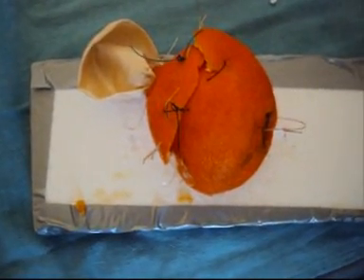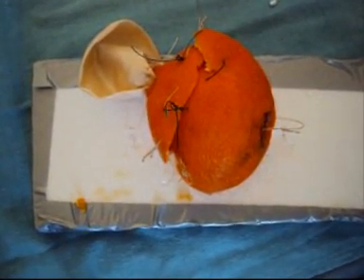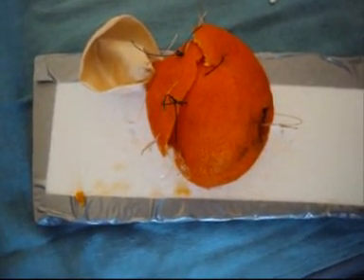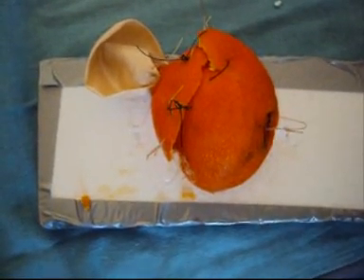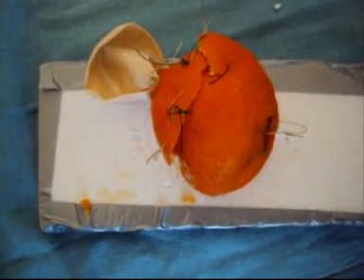So all up, this is a model which demonstrates the principles of anatomy of a simple open prostatectomy, but it could also be used with a laparoscopic approach, either robotic assisted or not. Indeed, this model clarifies some of the finer points of a procedure which is done less often today than it was in the past.